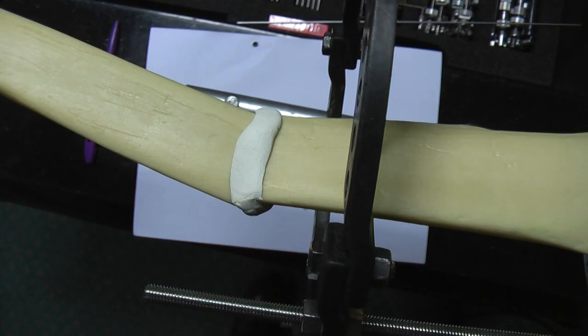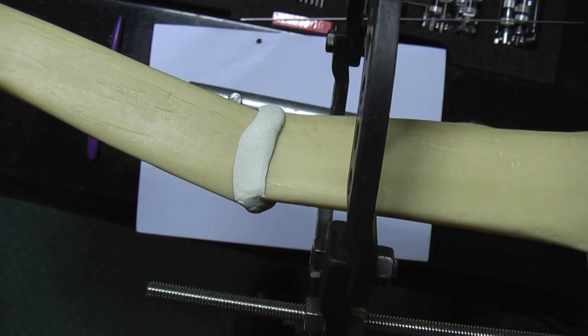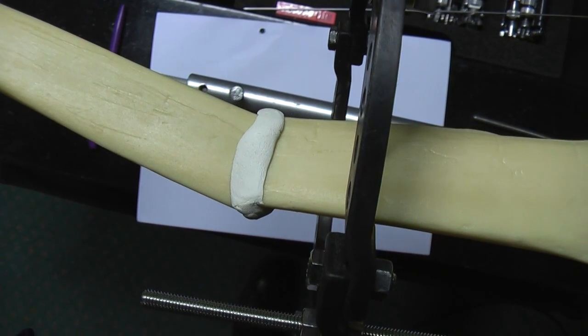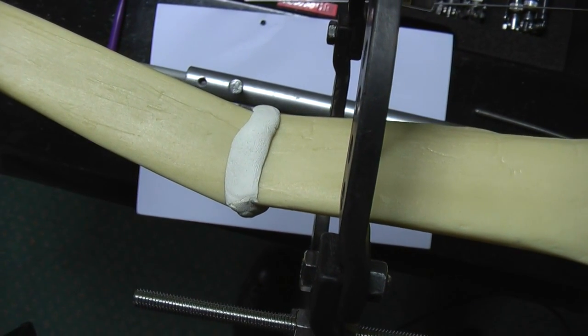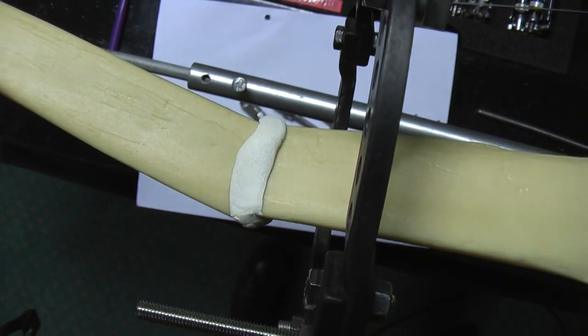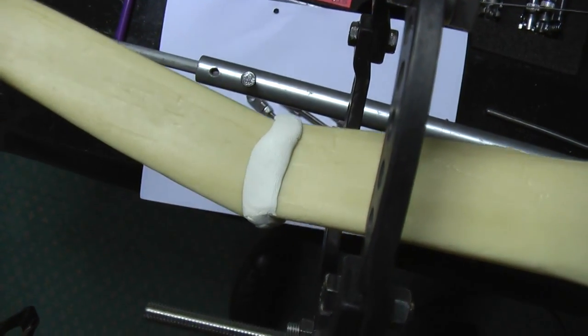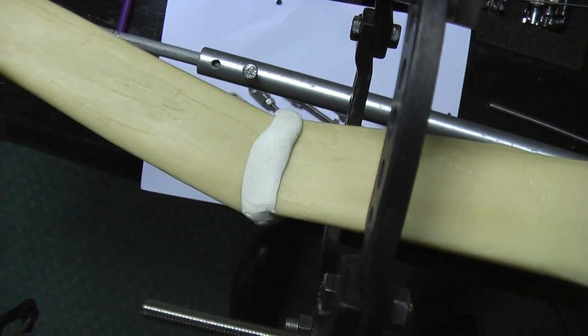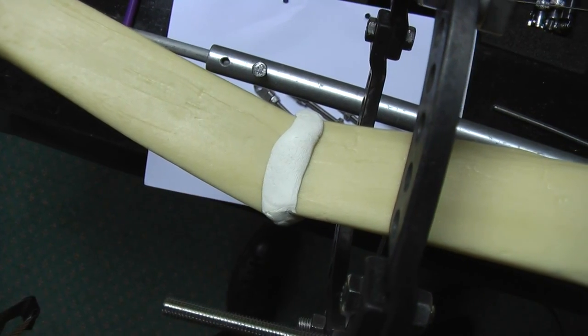If I was going to put hinges here, the bone wouldn't move unless we took some bone out. So there should be one hinge exactly there where we can see it, and the other one wants to be right around the far side of the ring in exactly the same plane. So basically, somewhere down there, off the middle of that lens. Does that make sense?